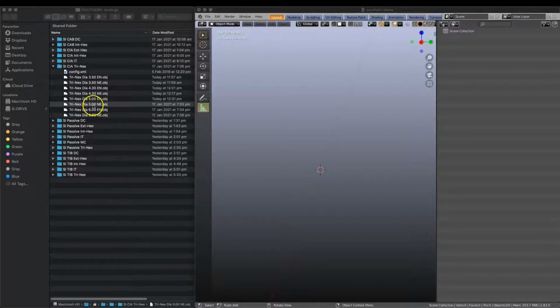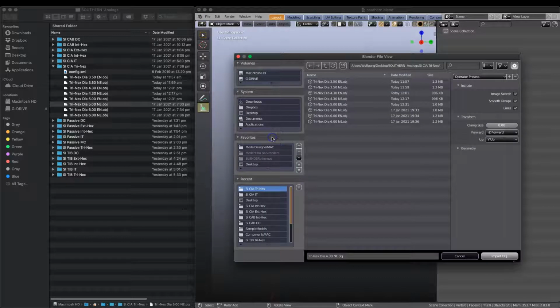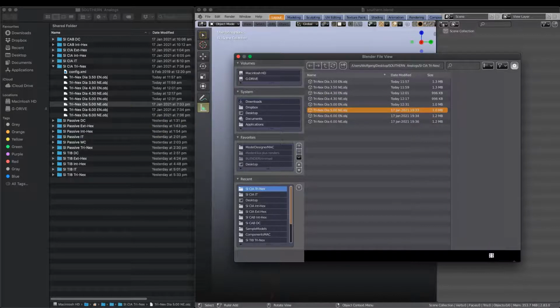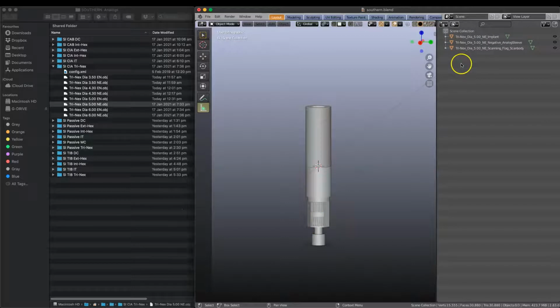So we'll continue with the 5mm NE in Blender, File, Import OBJ. So we're going to be looking for that here. This is the one. Make sure it matches, and then import. So the component standing upright, remember the Z-axis is facing upwards. So in the outliner window you'll be able to see that I have put suffix names onto each one of these files, and that is in the second category as well.